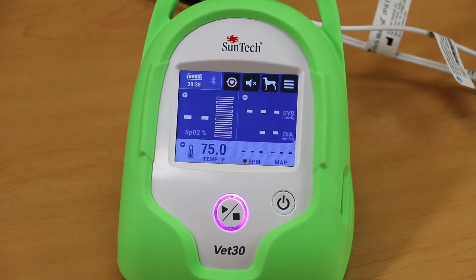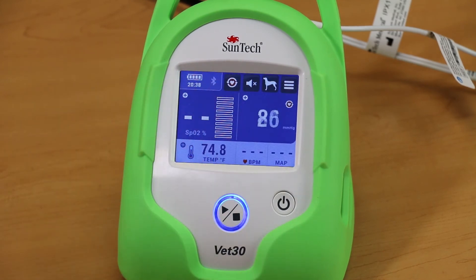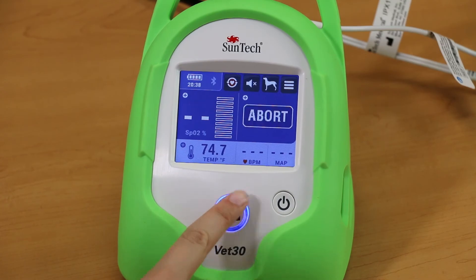The Stat mode on the VET30 allows you to quickly take back-to-back BP readings continuously for 10 minutes. To begin Stat mode, press the Stat mode button on the main screen. To exit Stat mode, press the Start-Stop button.